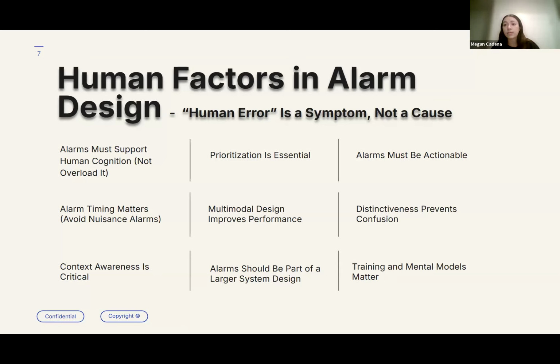When we go into regulatory standards, you'll understand a little bit more, as well as the usability, of course. How well does it function in this clinical environment? And even how well are people trained to use this? Does it make sense? Is it effective at reducing patient risk? And this is important because we've seen trained nurses go and use devices incorrectly, simply because it wasn't intuitive when to make a change, even with, let's say, images in GUIs or user interfaces, or even with manuals and instructions, because sometimes users don't have the time to process these cues while the emergency is happening. So it's really important we make them very simple, very obvious and effective.